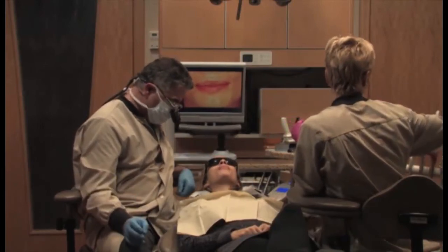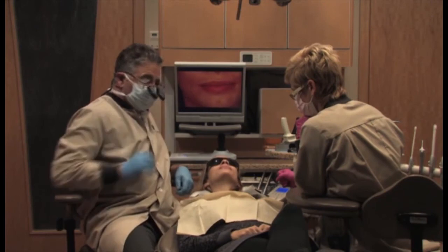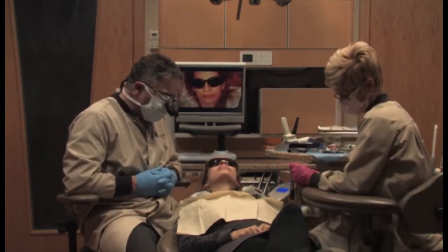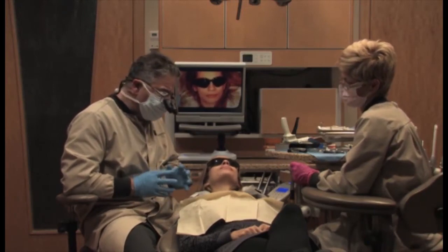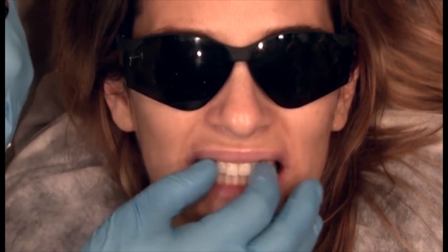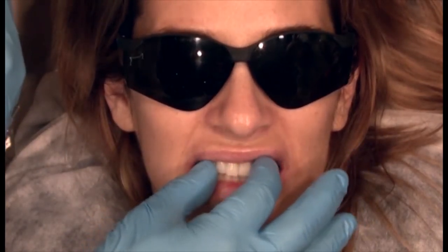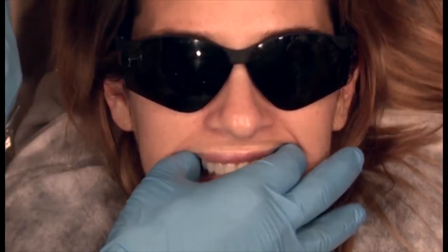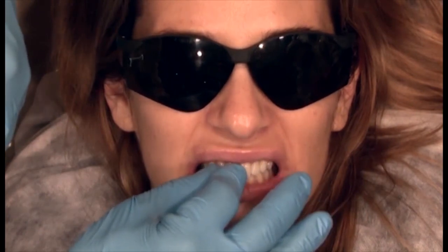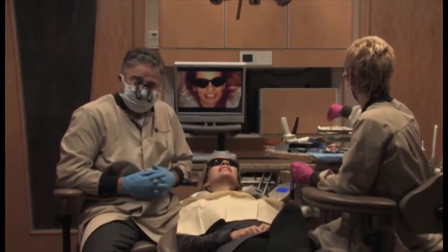How does that feel right now? Very good. Perfect. Perfect. Okay, that's the right word. You don't feel anything in the way at this point, and you don't feel like your bite can slide or move when you tap up and down. And then I'll take my fingers, tap up and down. I want to make sure I feel no fremitus on any of the teeth in the entire arch. Oh, feels perfect. Okay, that's perfect. I think we'll stop for today.